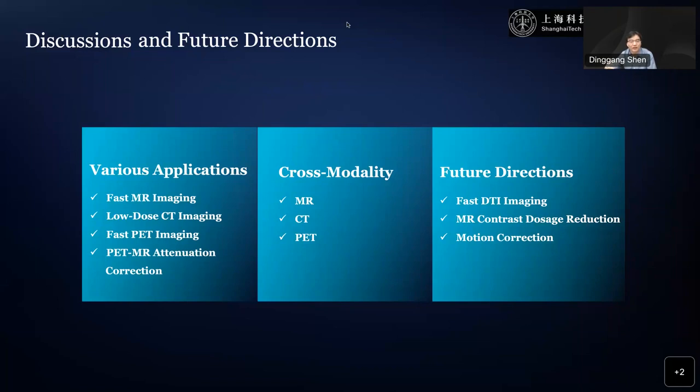Of course, right now this is one way. Of course, you can use a dual domain. For example, information from the image domain can also go back to the k-space. A lot of methods, like dual domain algorithms, can improve the image quality in the k-space before you do the inverse Fourier transformation to the image space. You have another deep learning algorithm try to complete information in the k-space, and then you map to the image domain and use another deep learning algorithm. So basically, it is dual domain optimization.